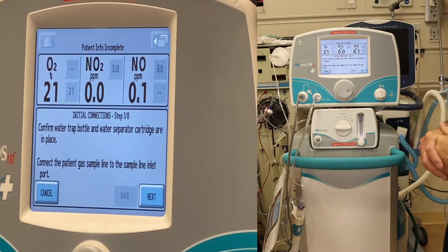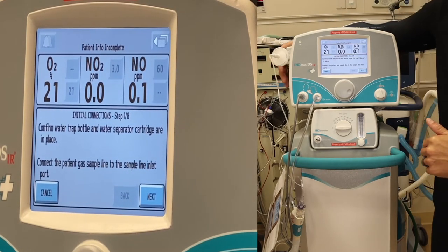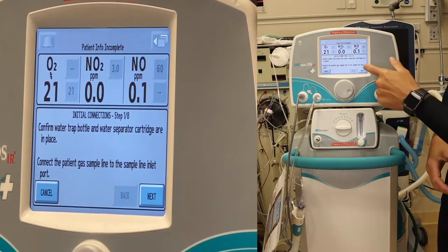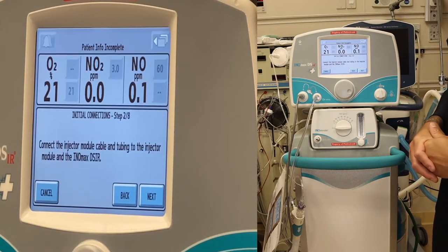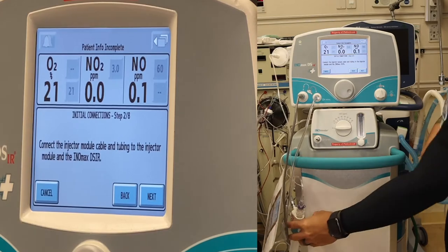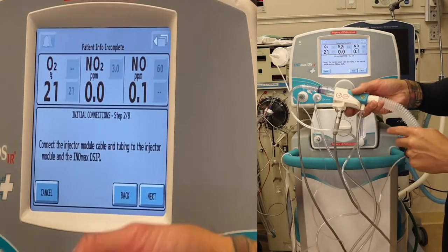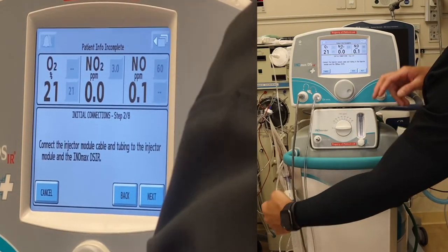First, confirm the water trap bottle and water separator cartridge are in place — done. Connect the patient gas sample line to the sample line inlet port — done. Press next. Connect the injector module cable and tubing to the injector module and the INO DSIR. These are your cables, your tubing, connected to our injector module — all done in our setup. Press next.